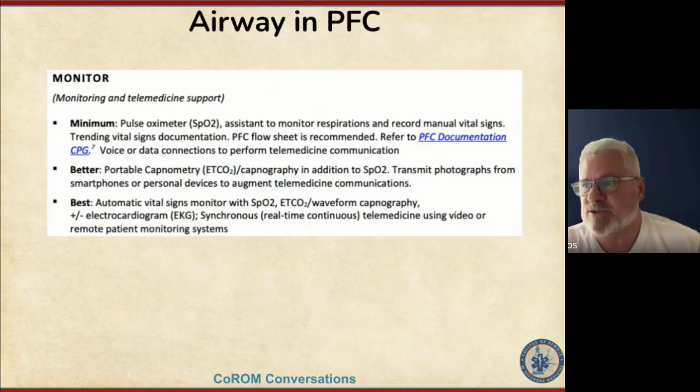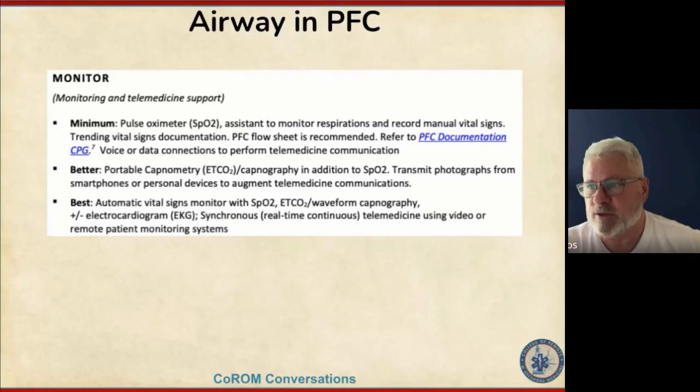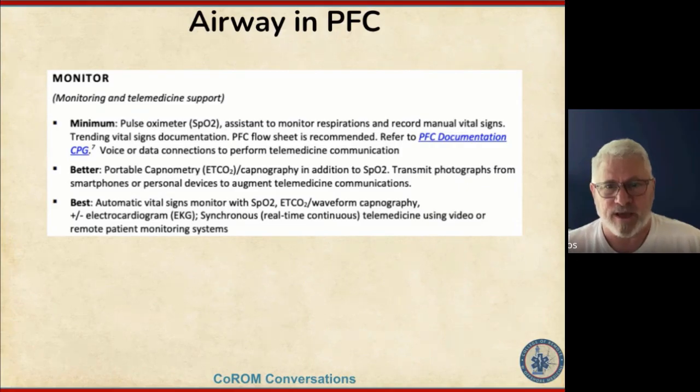Yeah. You've got a pulse oximeter, which is an excellent tool, right? Because it gives you a pulse, and it might even give you a pleth wave, give you oxygen saturation, all of those things. Those are good bits of information that you can get when you just look at your patient. Monitoring before this without equipment is looking at your patient, seeing where they are, and having enough of a reference to see whether their trend is to get better or worse.